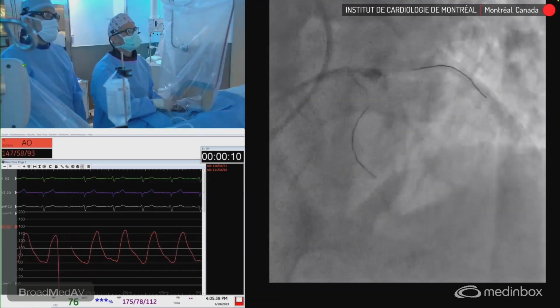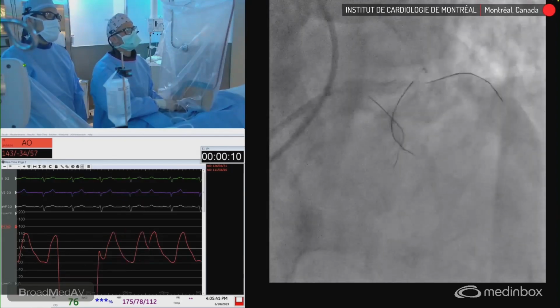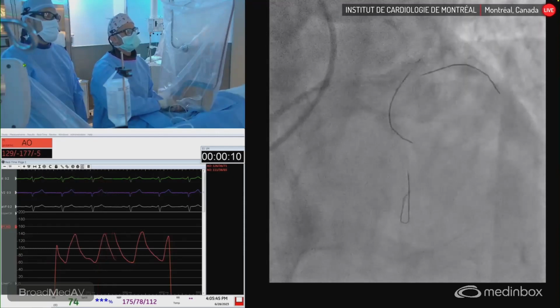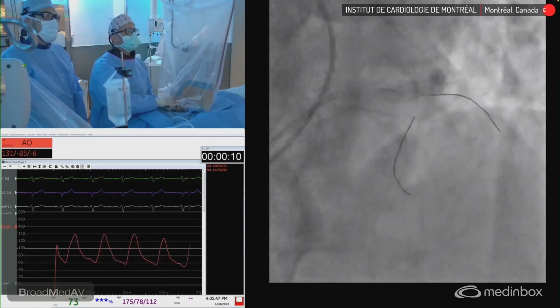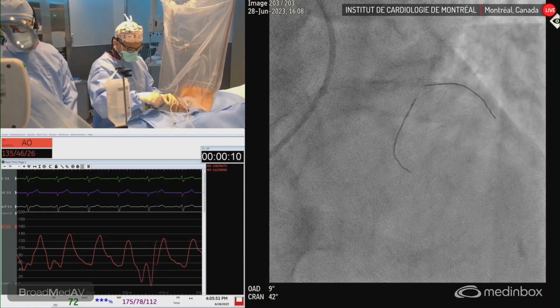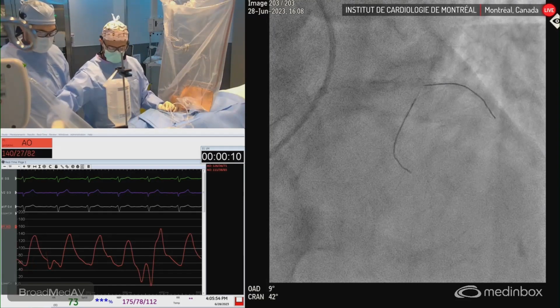That looks good. I think you're good. Yeah, you see, changing views may help a lot. You're there. Excellent. So I like this. This is the knuckle. Okay. Let's get the 2.5 balloons, maybe we can kiss first.